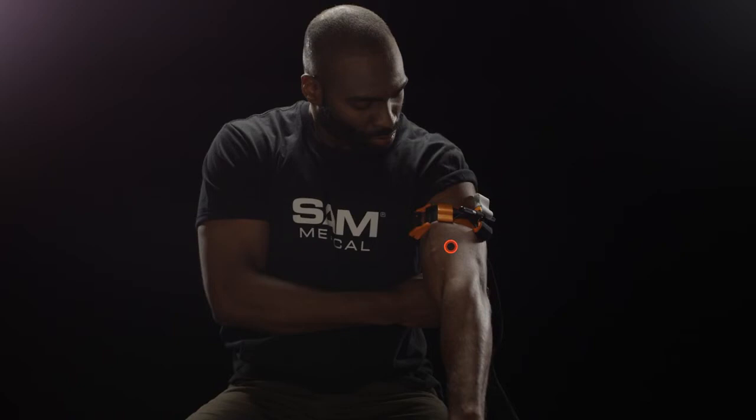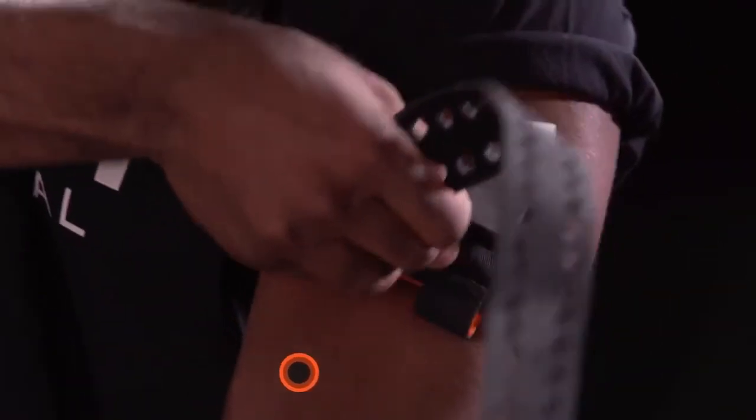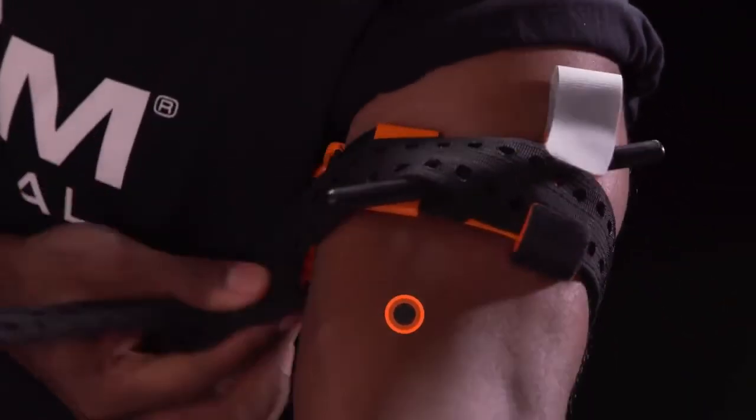If bleeding does not stop, apply a second Sam XT side-by-side next to the first. Wrap remaining strap inside the hook, over the windlass and around the limb.